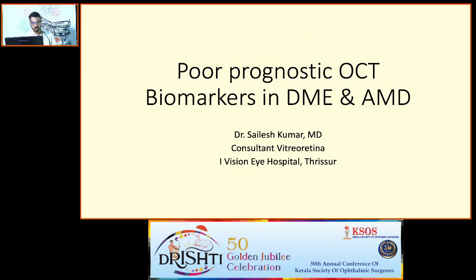I'll be presenting on OCT biomarkers in DME, poor prognostic OCT biomarkers in DME and AMD.